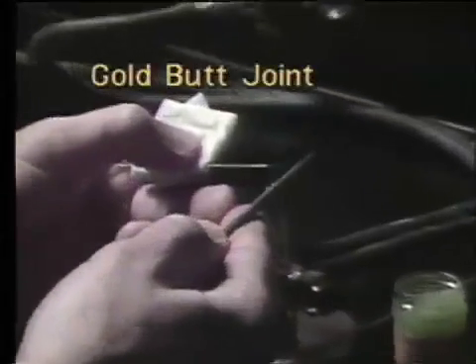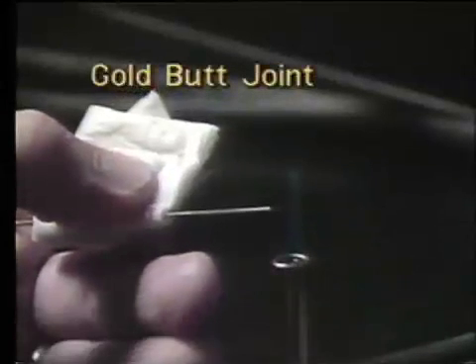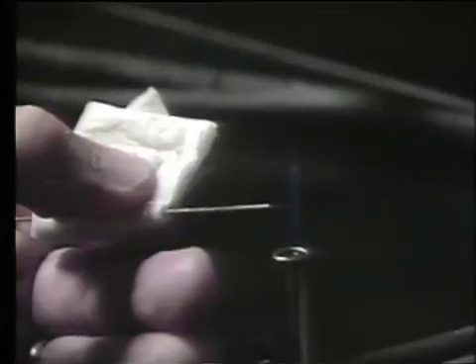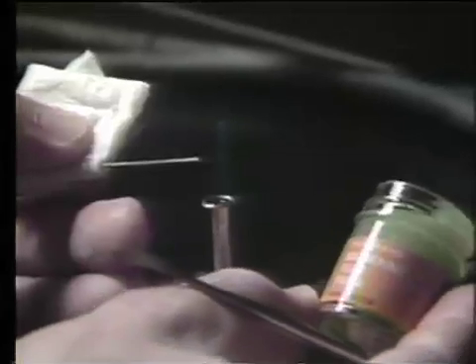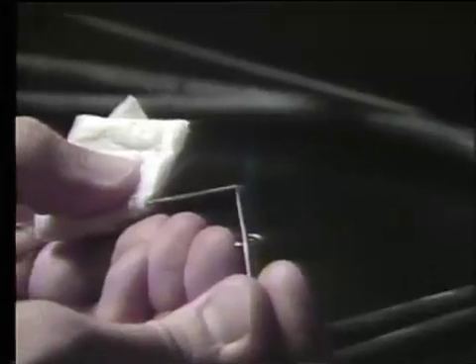To make the gold butt joint, the first step is to file off the end of a piece of .038 diameter gold wire with the lab file. The next step is to add the gold soldering flux to the end of the wire. A hand instrument is used to add this flux to the areas where you want the solder to flow — only on the end of the wire.